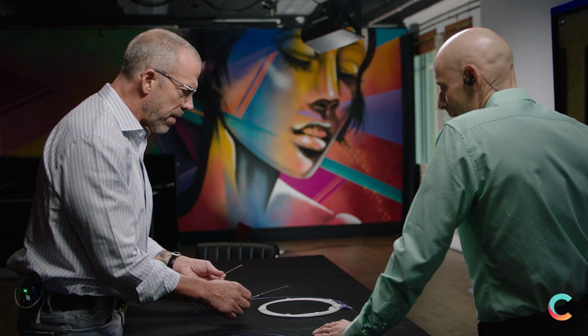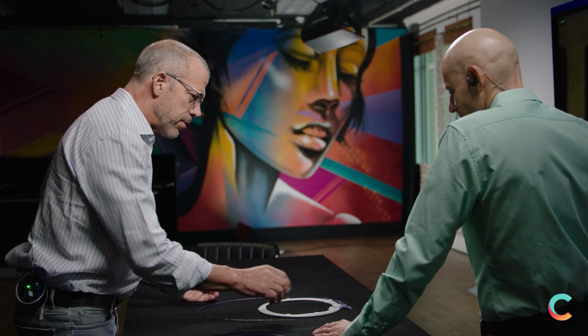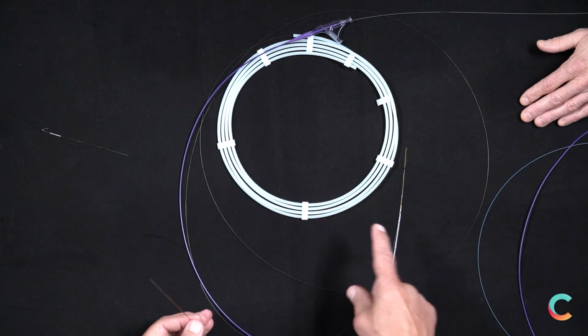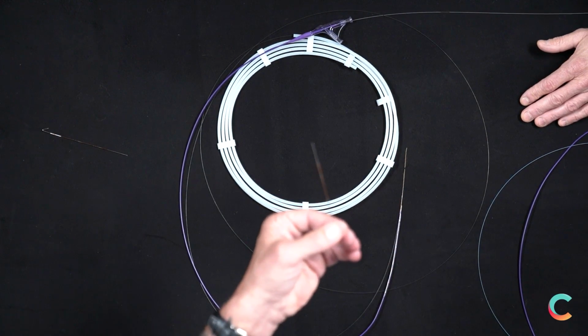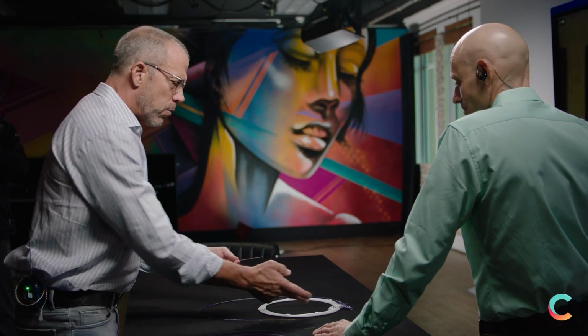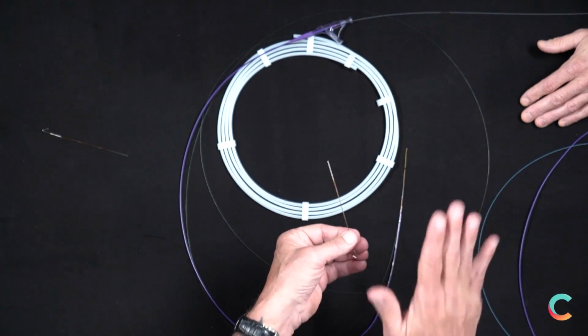And for me, that's time efficient. It's pleasing because I'm being more successful. It's simpler. So I think there's a lot of good aspects here. And so, the great additions by Gary on the clinical side. But now when we're talking about cost, we're talking about, instead of having 17 of these sitting on the floor somewhere, right? Now my rapid exchange is really at the distal tip where I'm applying the therapy to the patient, where the rest of it really is just the rails that's being delivered on.